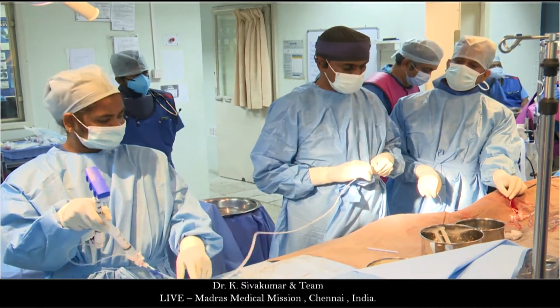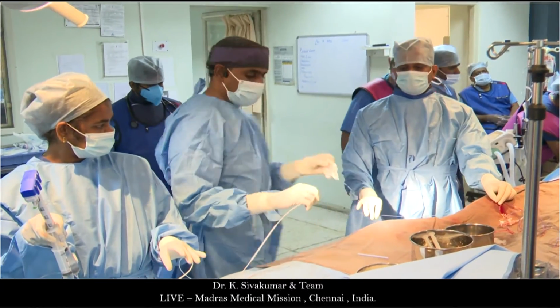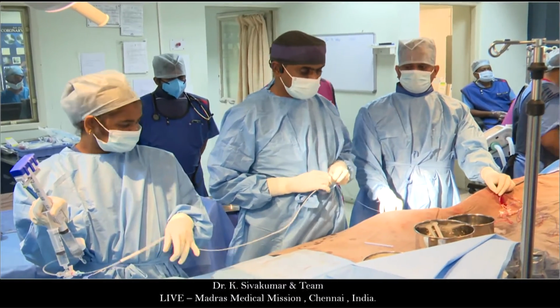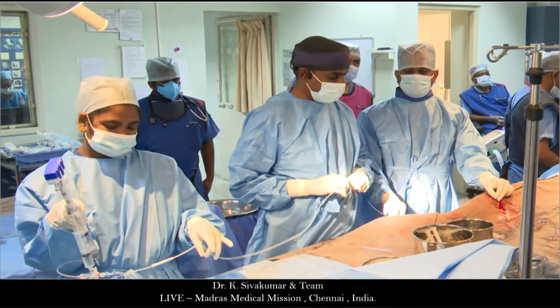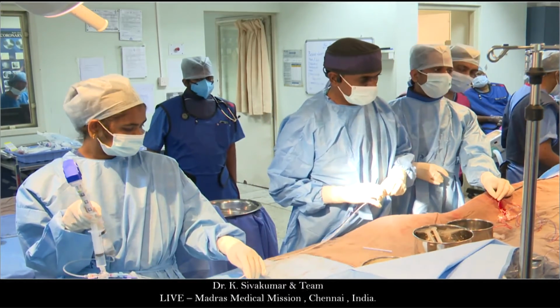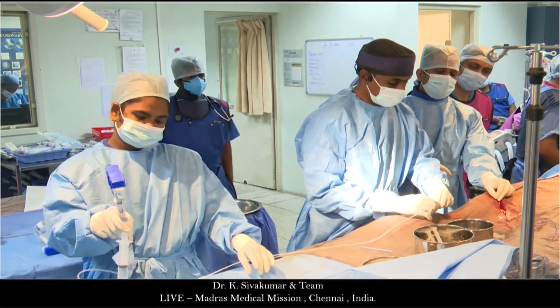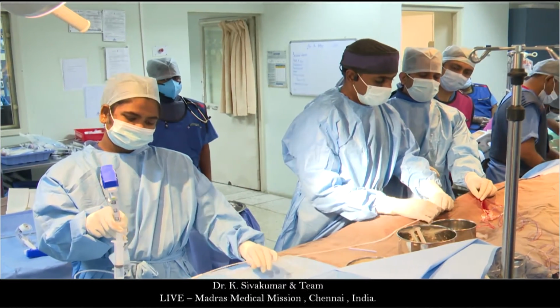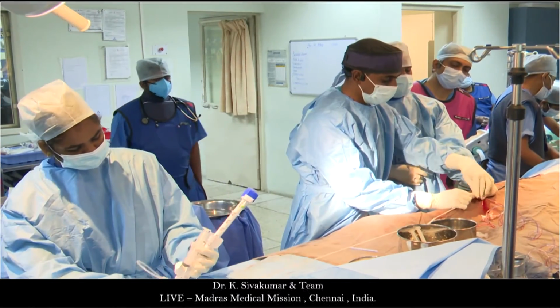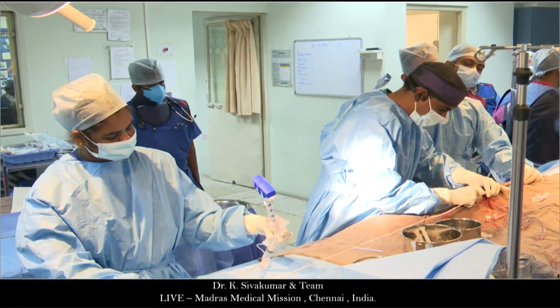The second thing about this stent is that there are no 8 centimeter balloons that we have of the size that I am using. It's an 18 millimeter balloon that I have chosen. I don't have an 8 centimeter balloon, so I am mounting on a 6 centimeter balloon, which means I'm going to have a distal unexpanded portion and a proximal unexpanded portion. Then I have to move the balloon and get it fixed.